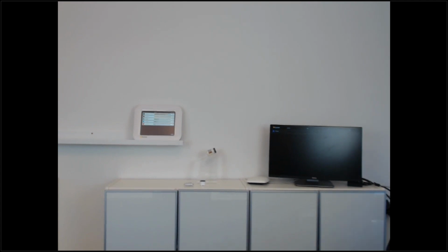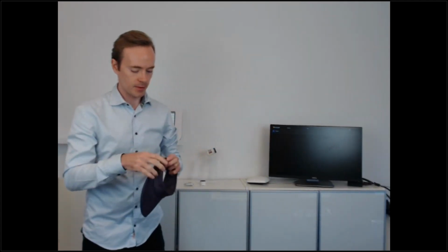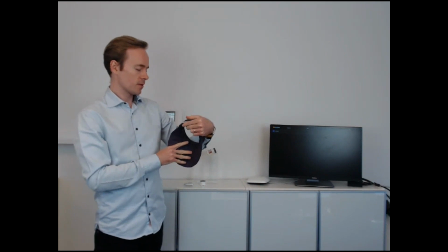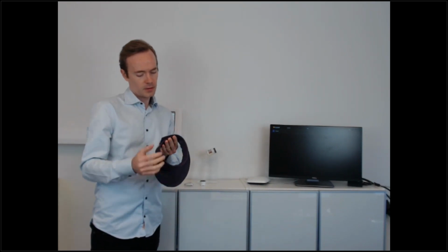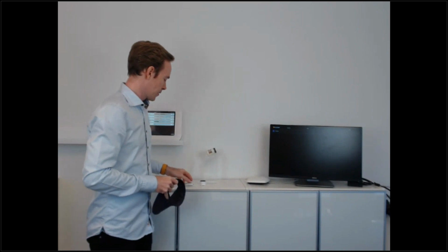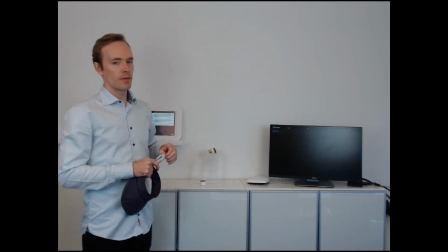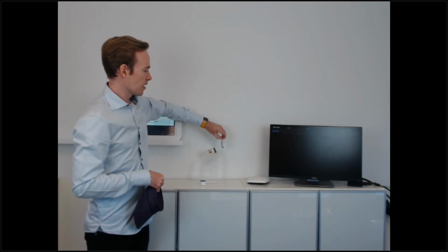Okay? And as a second example, I'm going to try shielding. Here's a thyroid collar, a normal one that you would have at the dentist or in the cath lab. It's got, I think, 0.25 or 0.5 millimeter lead. And let's imagine that this is one of the ceiling suspended shields in the interventional room. And let's say I'm the operator or the anesthesia nurse, for example. Someone who's close to the patient and should be using a shield. And right now, I forgot my shield.